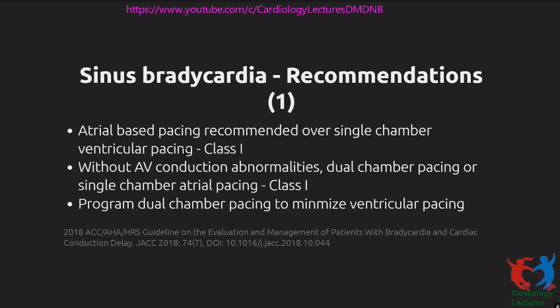So I would go as far as to say that probably patients paced with a single chamber ventricular pacemaker do worse than those who are not even paced. Even though there's no trial data on that, I would say that they do worse. So please do not pace VVI in patients with sinus bradycardia.